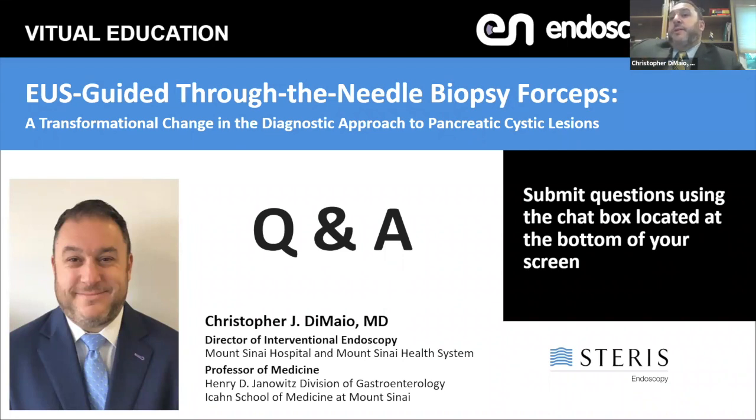And you're sort of withdrawing the scope, pulling it back. Depending on the patient's duodenal anatomy, you may just slip right back into the stomach. Often you're doing all kinds of weird things with your body, your back maybe to the patient, in order to maintain the torque. But that's typically what I would do.